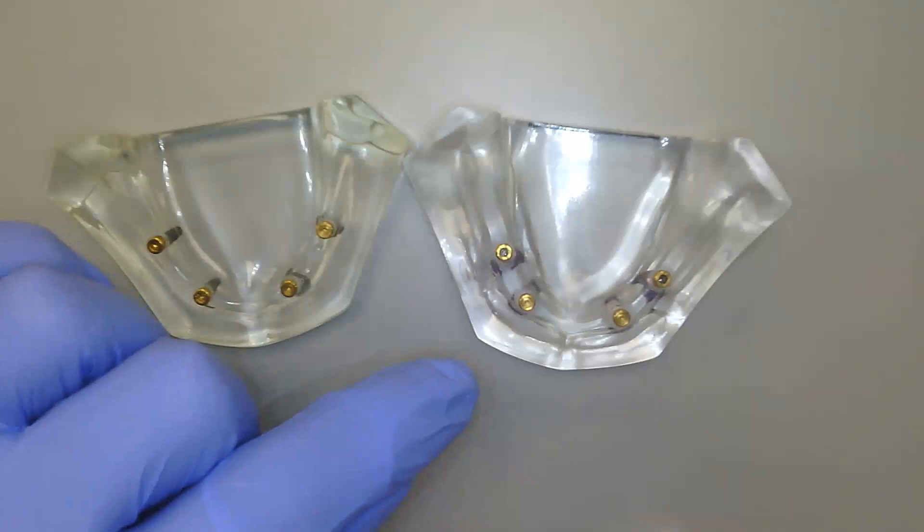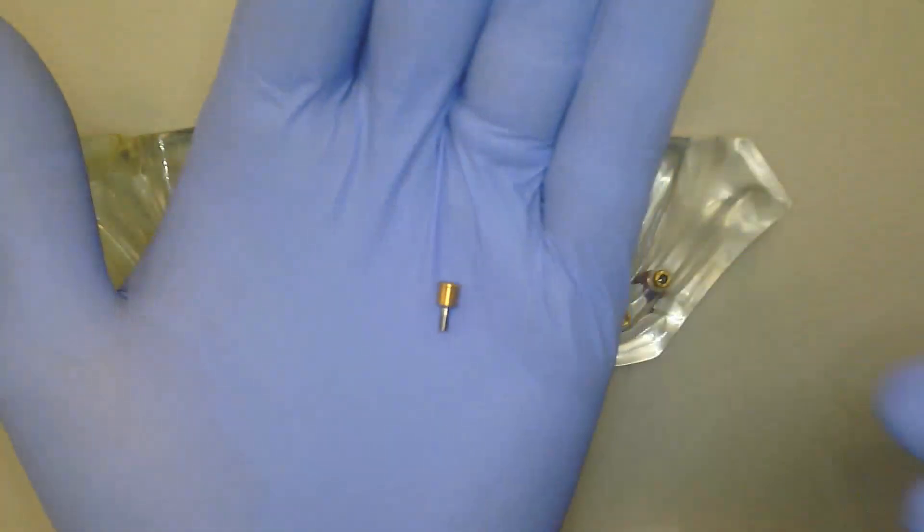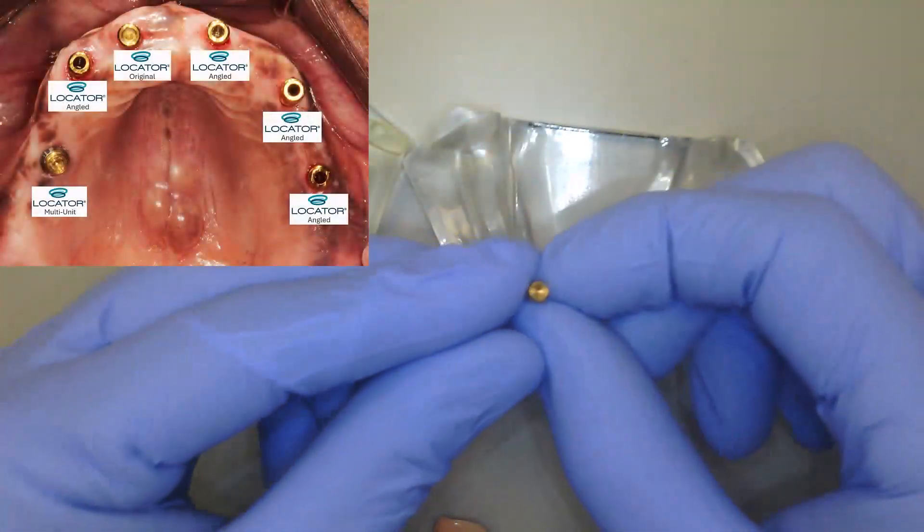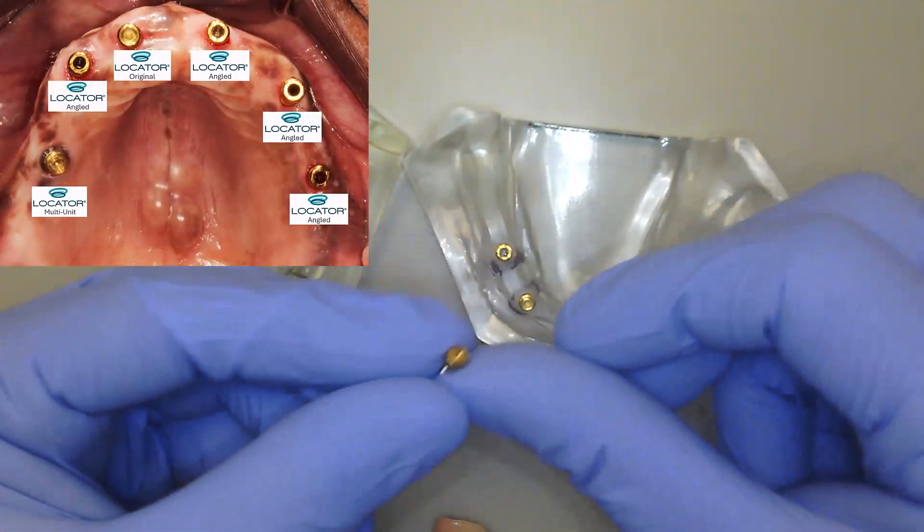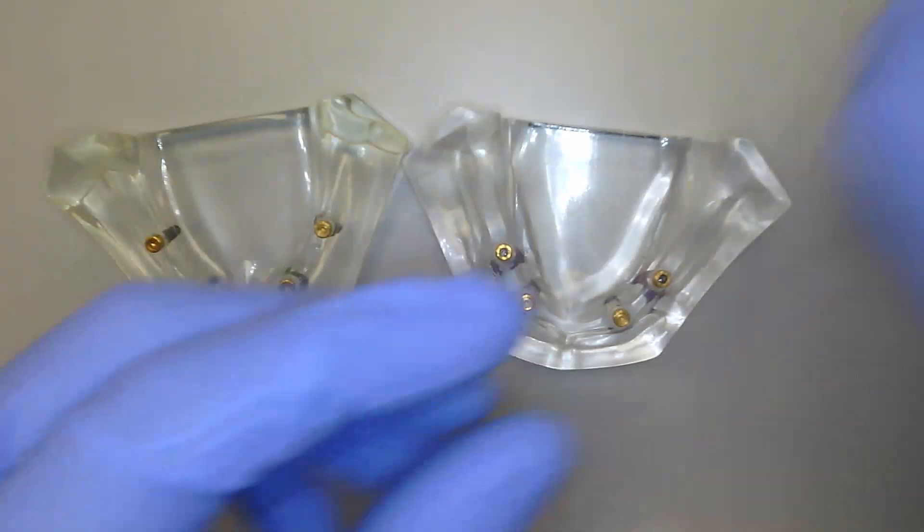The locator versus the locator angled abutment is going to be looking like this. So this is my standard locator abutment, and when I take a look at it here, we'll see that we've got that triangular appearance as well as the gold abutment.